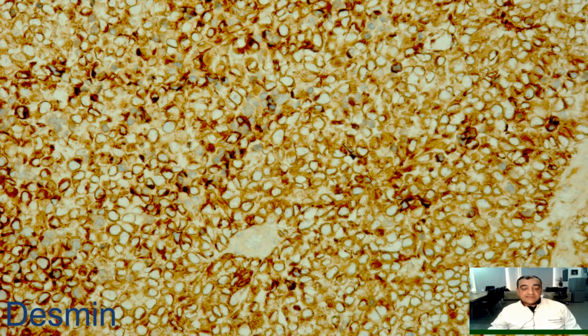Next step, in immunohistochemistry, we must include more antibodies, first of all to differentiate myogenic origin. Here shown is the desmin, very nice, intensive cytoplasmic staining.